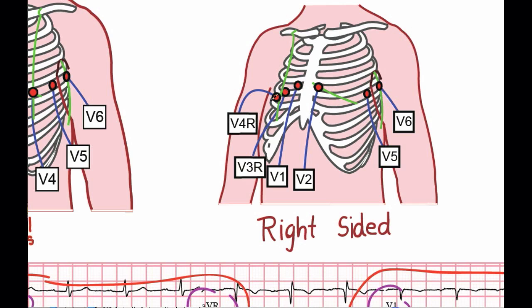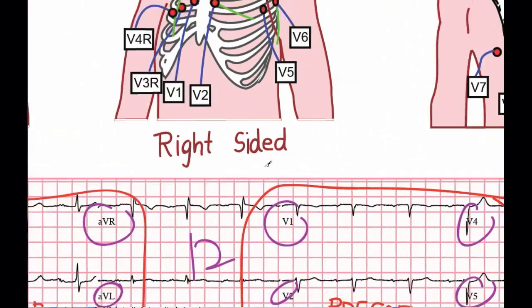V4 is placed in the fifth intercostal space, midclavicular line, this time on the right. You could leave V5 and V6 on the left side, or you could move them to the right. Now remember that V3 and V4 are moved over, but the EKG machine doesn't know that. So on the paper, cross out V3 and cross out V4 and write V3R and V4R, for example.